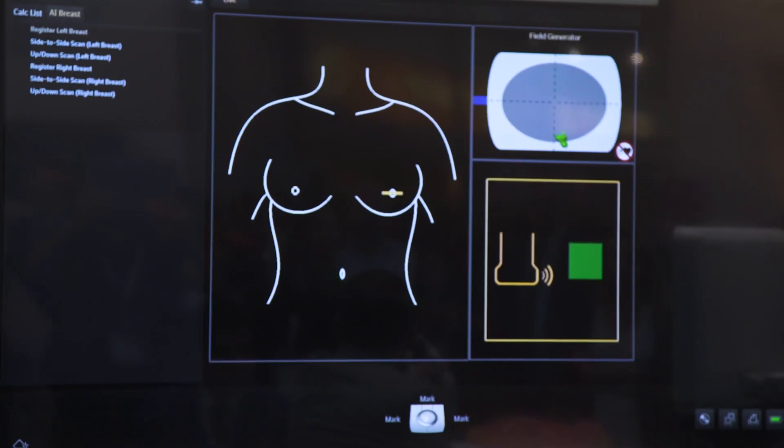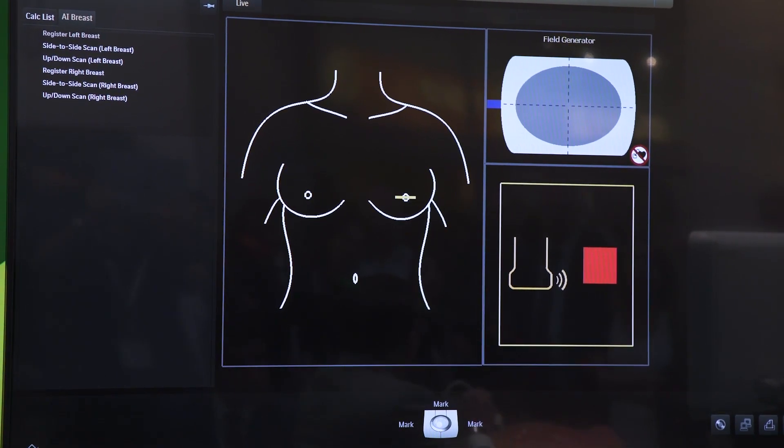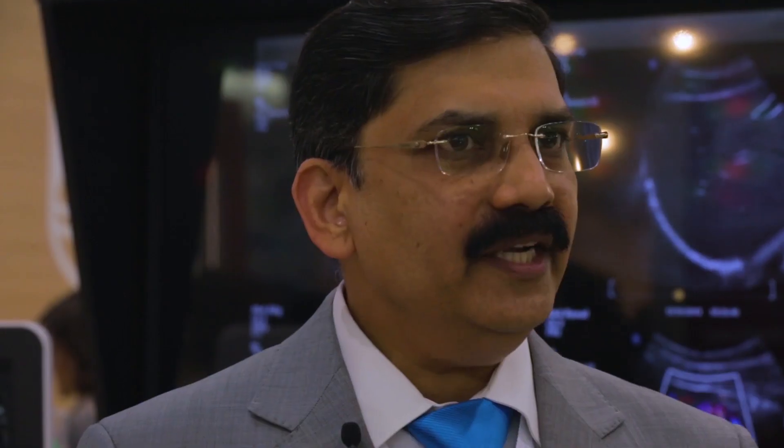You press Anatomical Intelligence for Breast on the touchscreen and it opens up into this particular screen. As you can see on the graphic, the system tells you to identify certain landmarks. You can identify these landmarks in just a few seconds, and then the system is ready to scan.